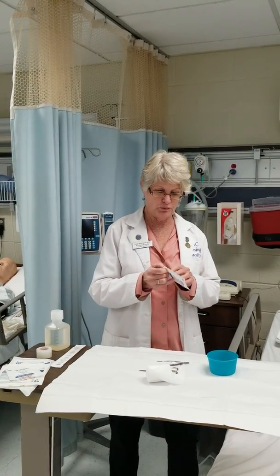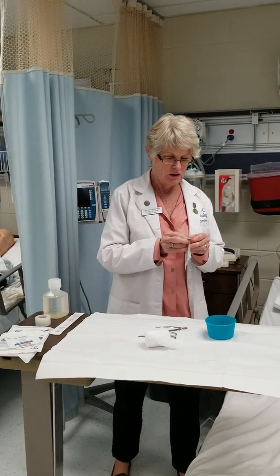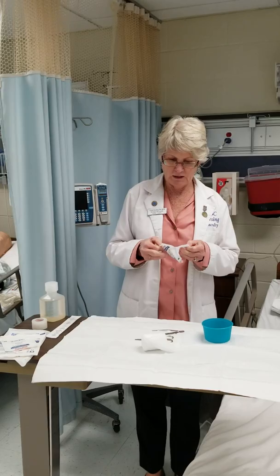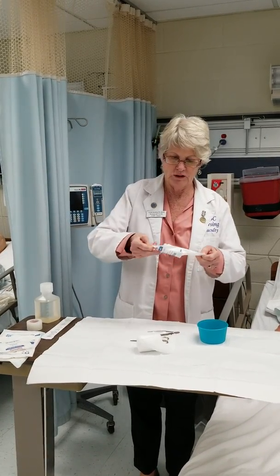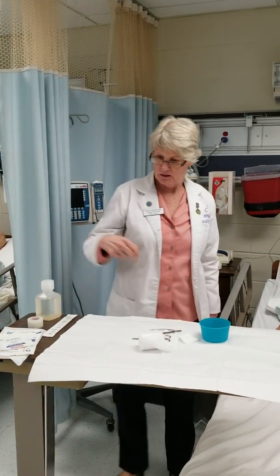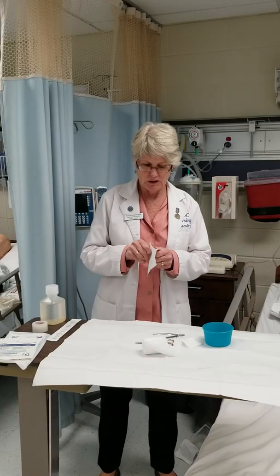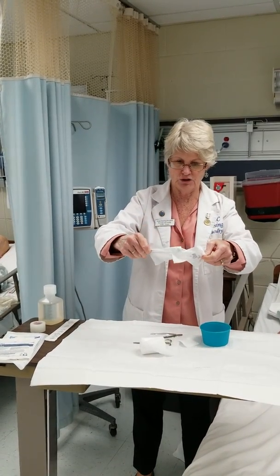I will peel open my sterile 2x2s. I have 2 packages of these. And I will open them. Again, I'm stepping away from my field till I'm ready to drop them on, at which time I drop. The next one, same thing. I will pick up my packaging, peel it open, and get ready to drop this on my sterile field.